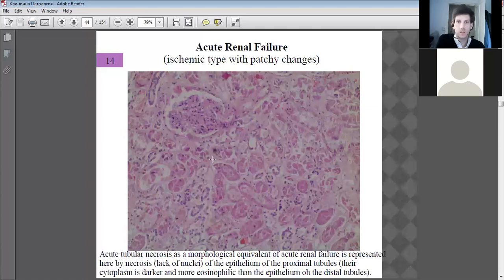Yeah, I think that's about it. You might want to mention that the membrane or the capsule has a normal conformation there. It's normal around there. It's fairly normal. And the space in the Bowman's capsule looks a bit normal. However, there is some debris forming, but it looks fairly uniform in terms of its bow shape.